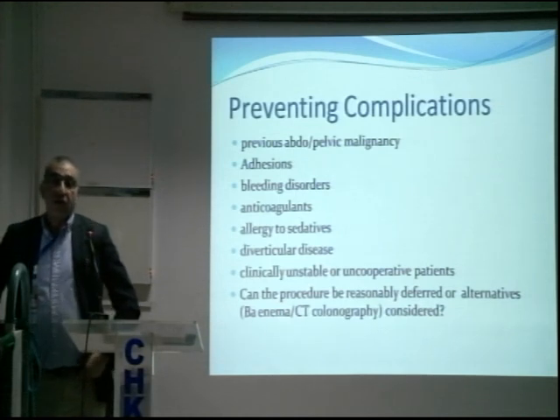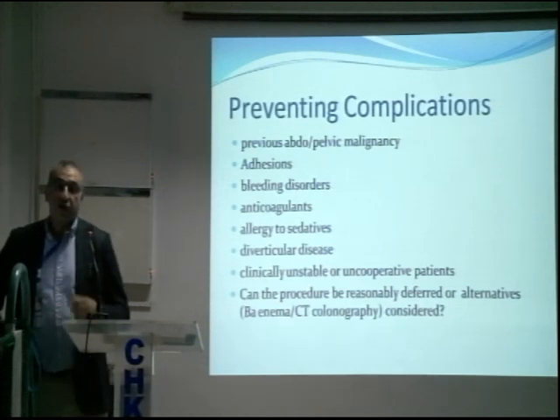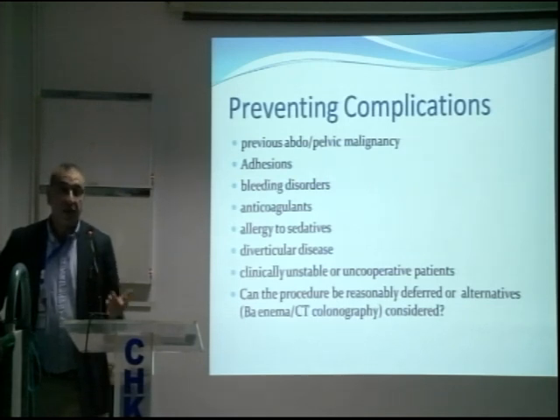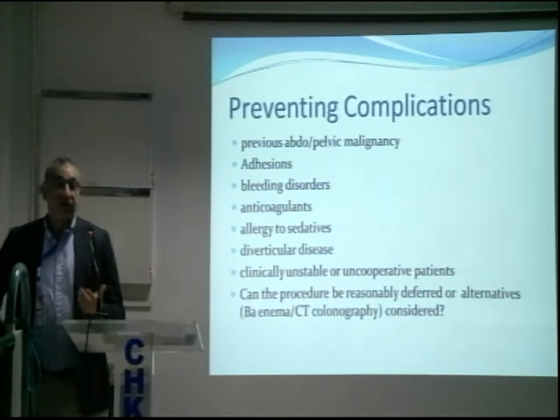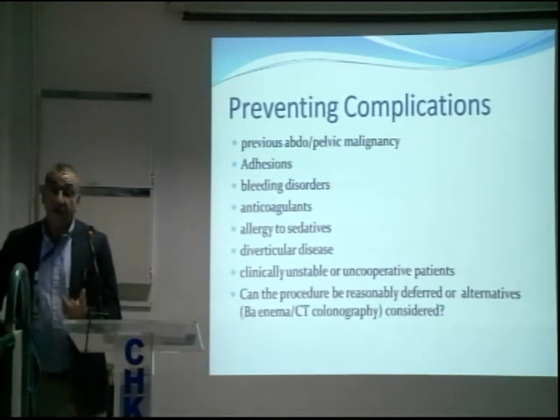Women who have undergone any hysterectomy, those are the worst for colonoscopy. They make the colonoscopy more difficult for you due to adhesion and tethering, or for that matter, any previous abdominal procedure would make it more difficult.